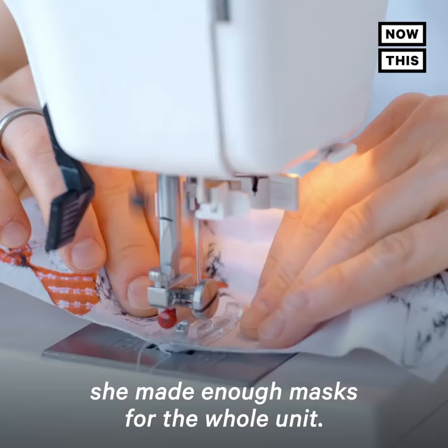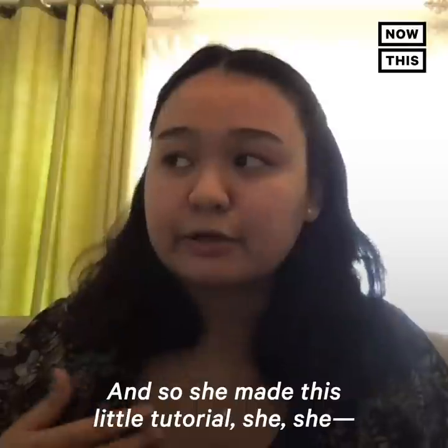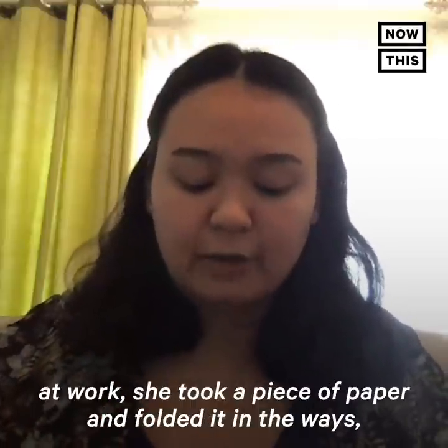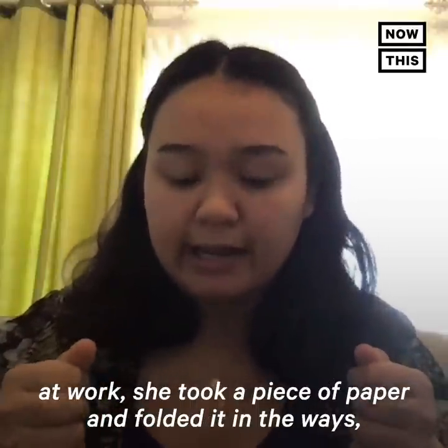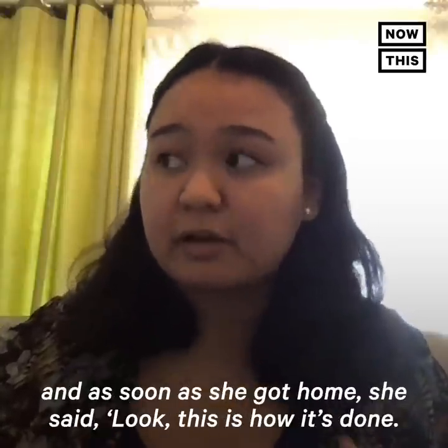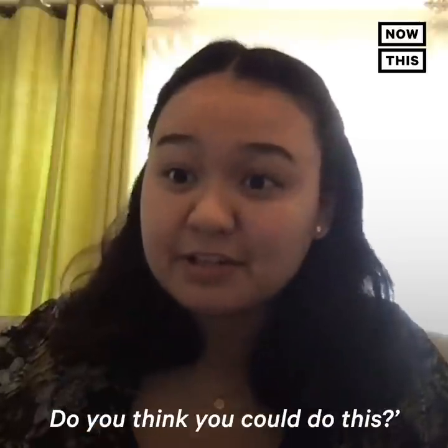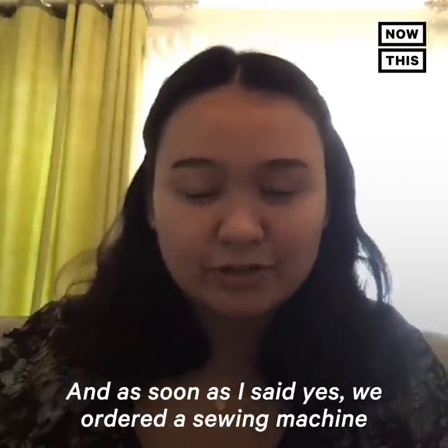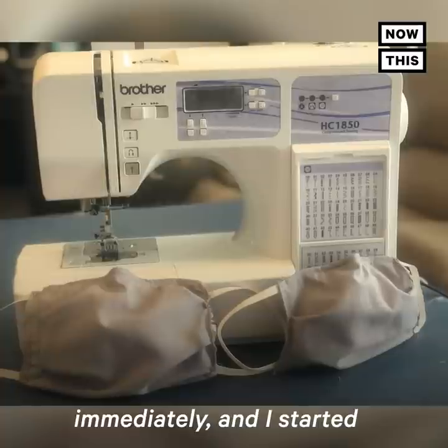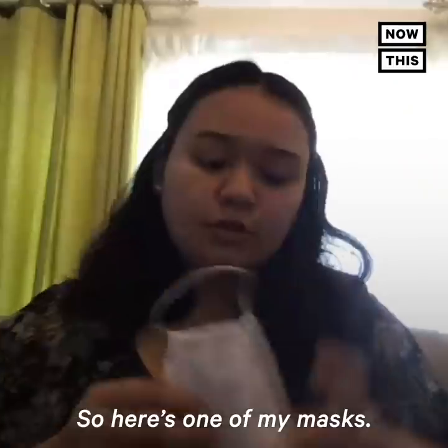One of my mom's co-workers made enough masks for the whole unit and made a little tutorial. At work she took a piece of paper, folded it to demonstrate, and narrated it. My mom filmed it for me, and as soon as she got home she said, 'Look, this is how it's done — do you think you could do this?' As soon as I said yes, we ordered a sewing machine immediately and I started making masks as soon as it came in.